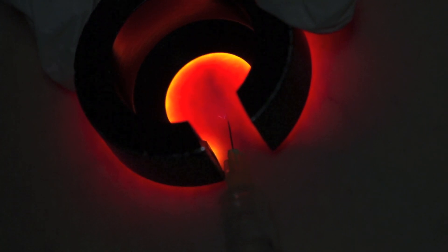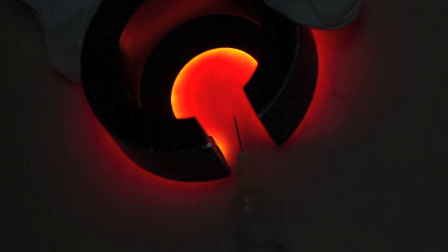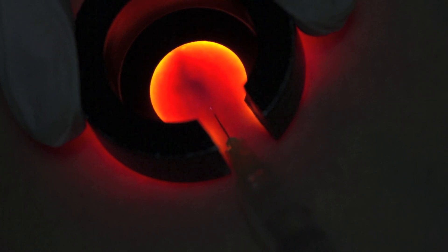The successful injection of the sclerosant displaces the blood in the reticular vein with a clear colourless sclerosant solution. The silhouette disappears.